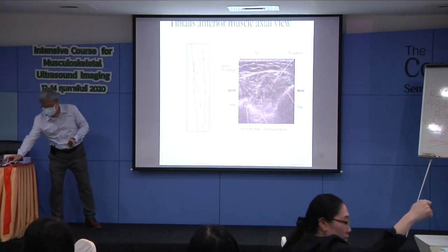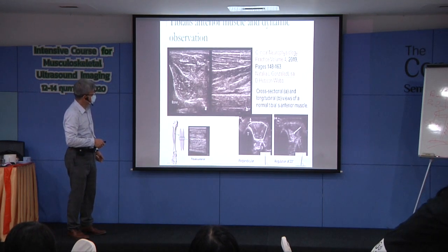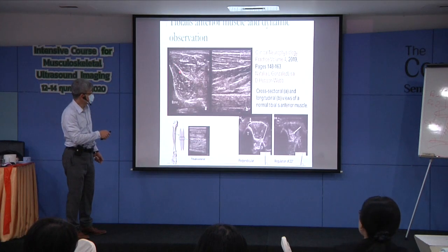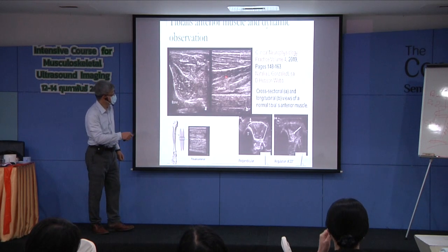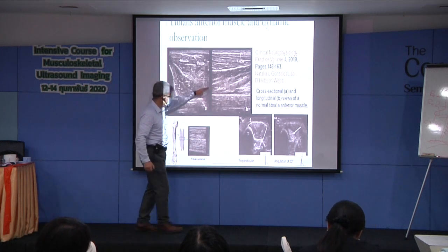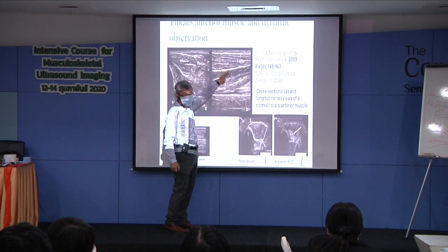Okay, thank you. Then high resolution ultrasound. This is the central part, right? Central part of the leg. Bipennation. The angles are different. The superficial part is flatter. The deep part is sharper.